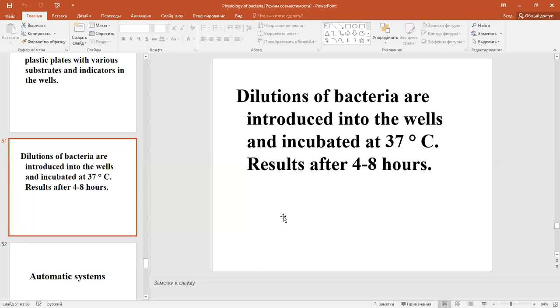They are one-time-use plates, and they are industrial, they are commercial, they are produced, and very often such multi-micro tests are used for identification of the Enterobacteriaceae family. Enterotest 1, Enterotest 2, and different substrates are absorbed in dippings of these polystyrol plates. So it is possible to detect many enzymes.